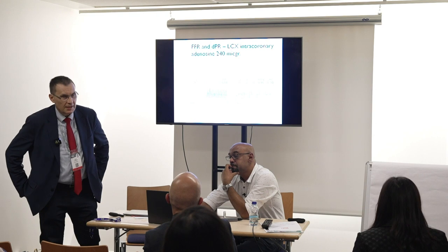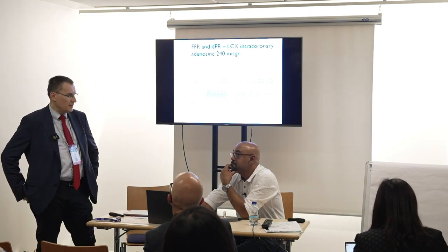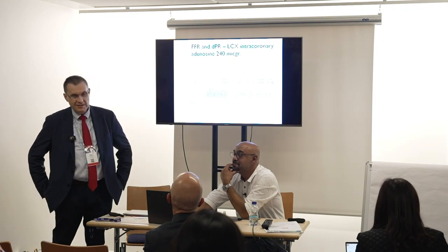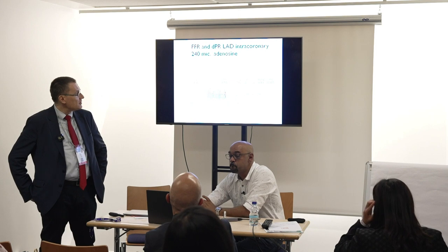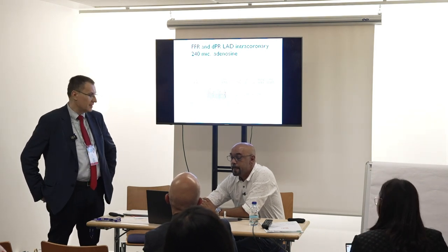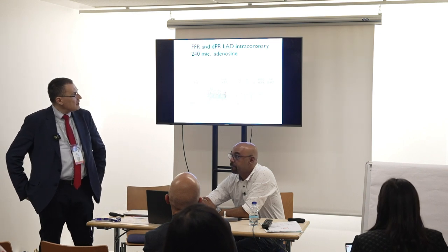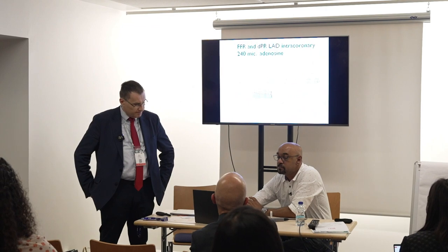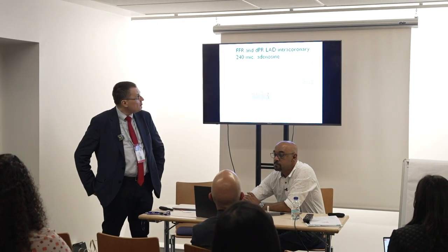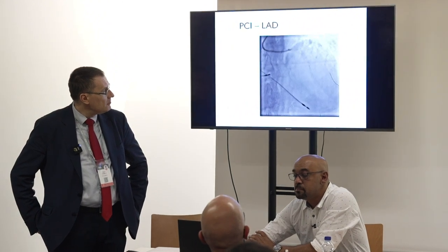So the patient at this point went from three vessel disease to a one vessel disease patient. We made also FFR on the LAD. On the LAD, FFR was clearly significant without any doubt. Even the DPR was very, very impressive. So we proceeded with the PCI, with predilatation with a long balloon.